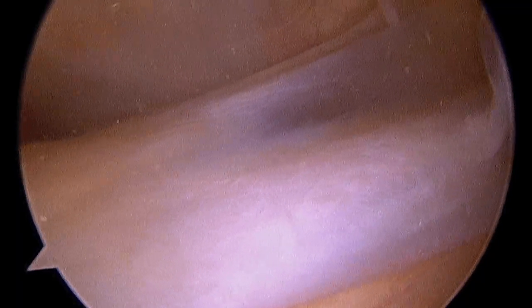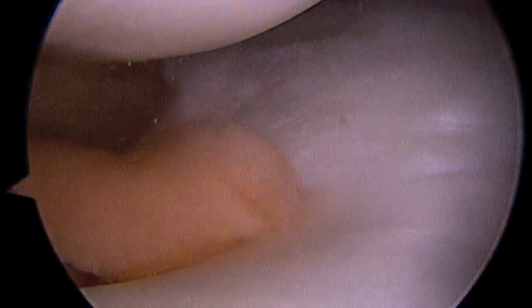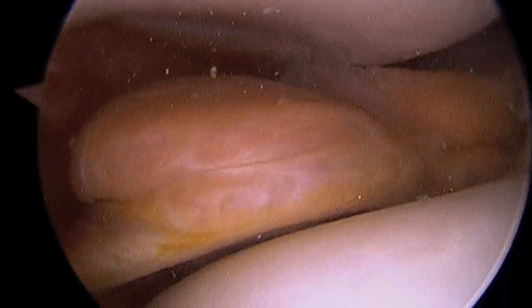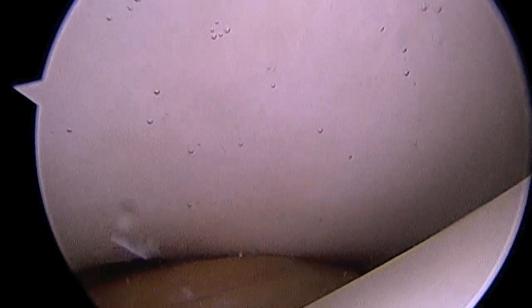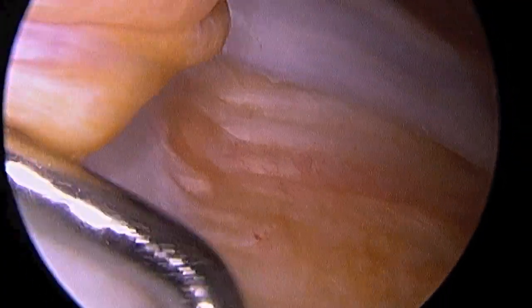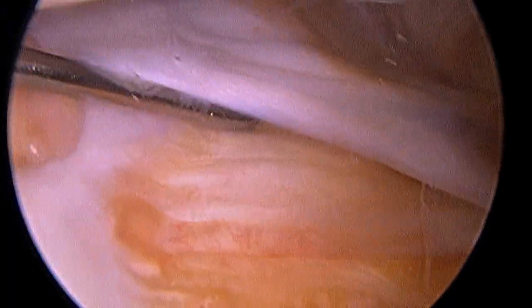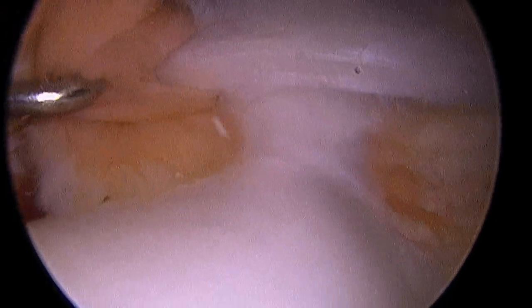Here we have a slightly different perspective than the last video. We're looking down at the patellofemoral joint from a superior lateral portal. There you see the white tissue of the plica, and to the left coming into view, the mass seen on the MRI. Now you'll see as we bend the knee, the kneecap starts to entrap on top of that plica as well as the soft tissue mass. As I manipulate the mass with the probe, you can appreciate its size. Here you see the suprapatellar plica and how it's incorporated with that medial plica, and how both of those are entrapped between the kneecap above and the trochlea or groove below.